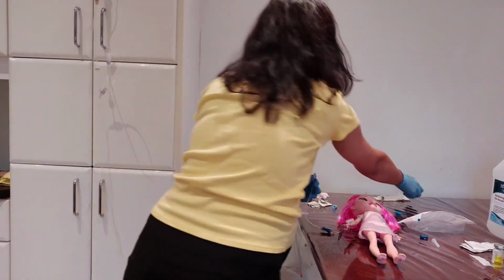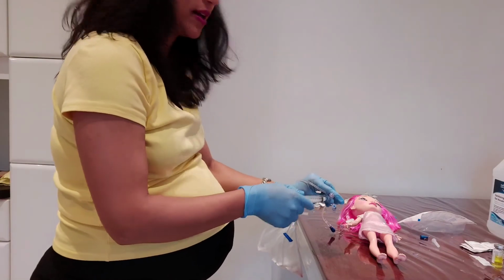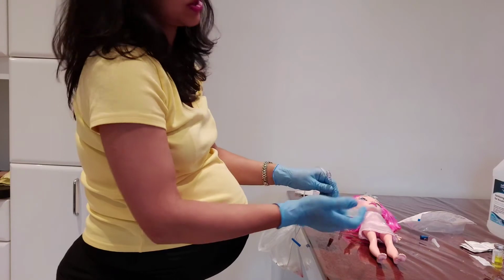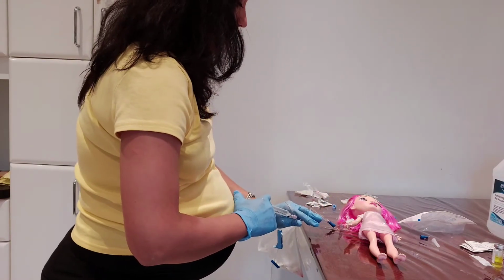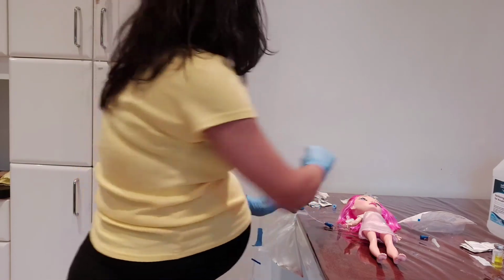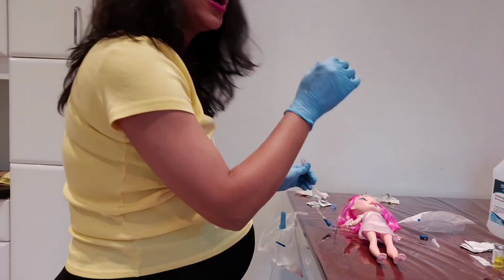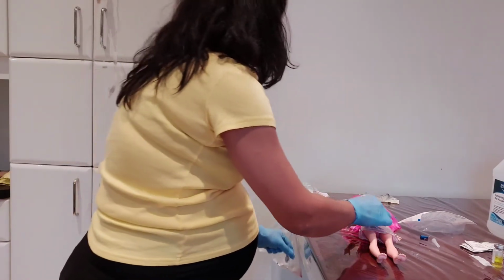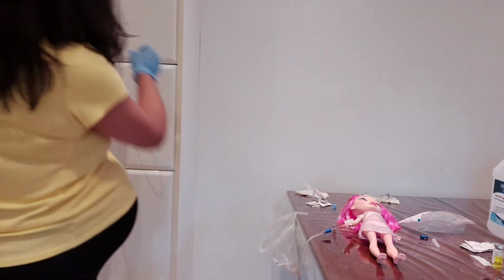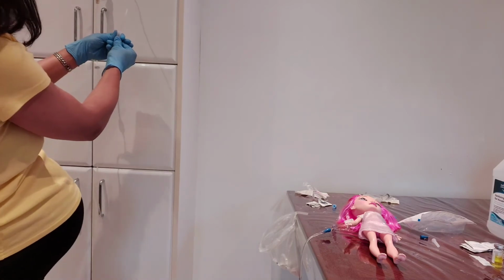Before I open it, I will flush this port with the normal saline. I will flush it and then make sure there is no blood here, no blockage, everything is okay. Then I can open the secondary line. I will open the secondary line.